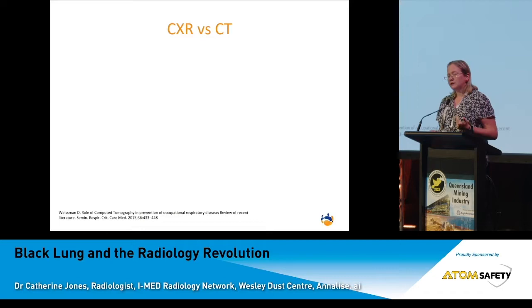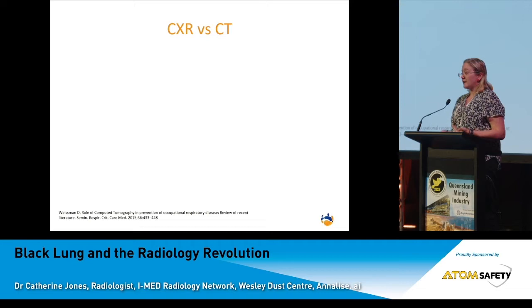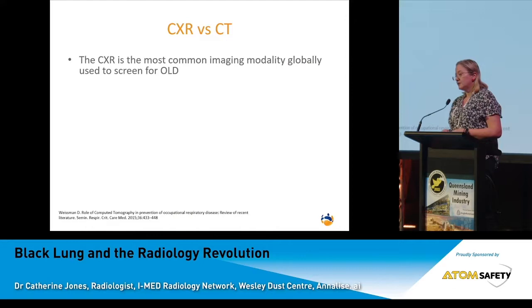Now, one of the really key developments in this entire space of screening and regulation is the debate about how we should be assessing people's lungs when they come for their screening test. Should we continue doing the chest X-ray, or should we require people to do a CT scan? And why should we do a CT? Well, chest X-ray has the advantage of being really easily available. It's available pretty much in every town in Australia.